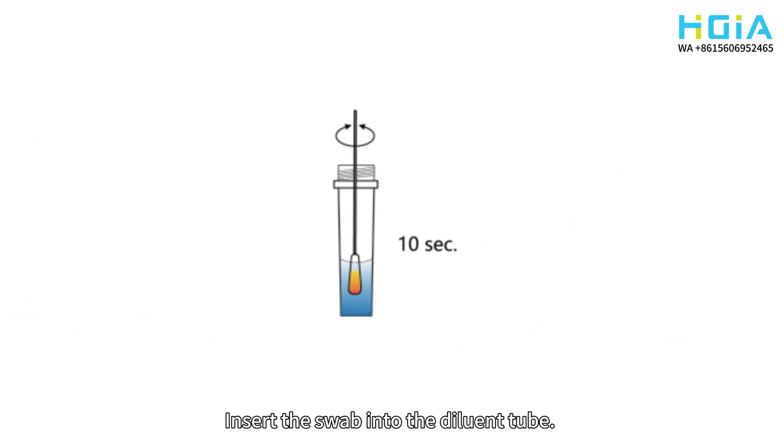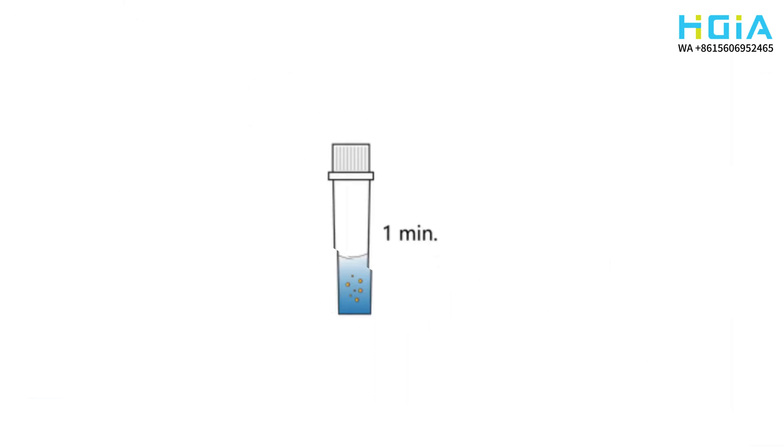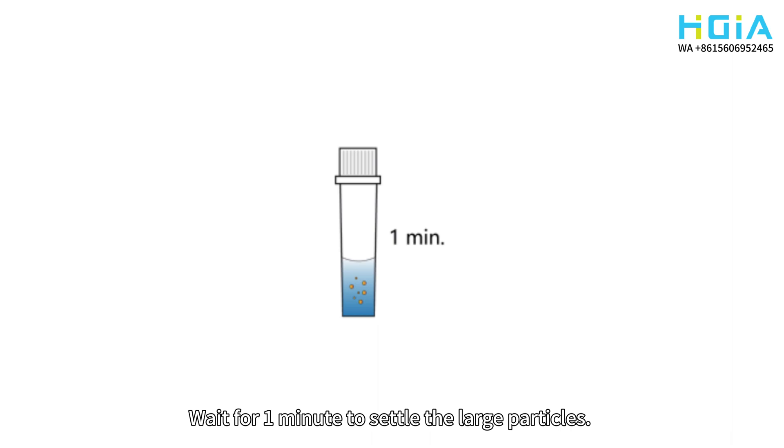Insert the swab into the diluent tube and mix the swab until the specimens have dissolved. Wait for a minute to settle the large particles.